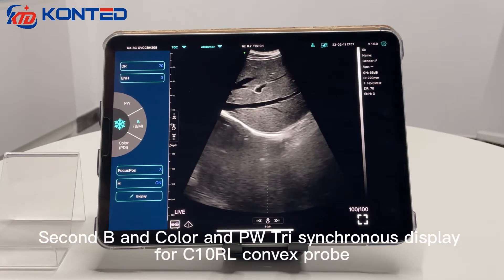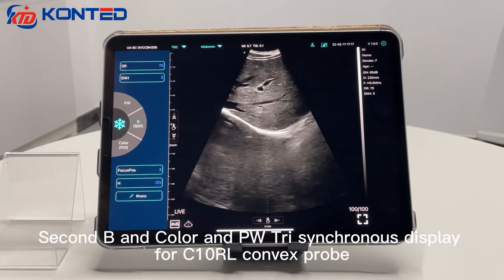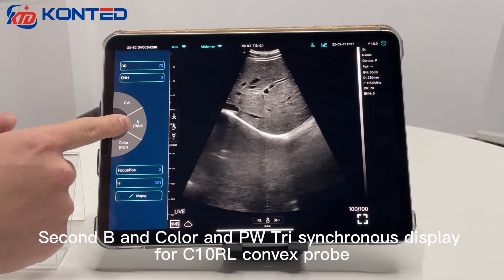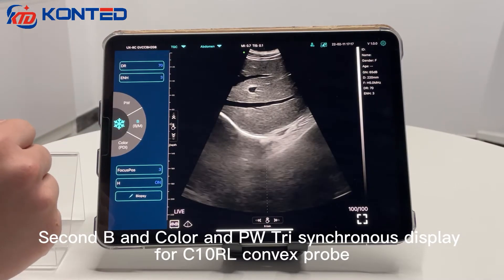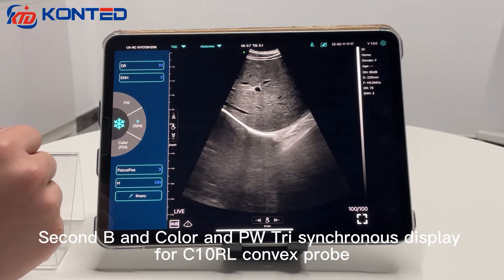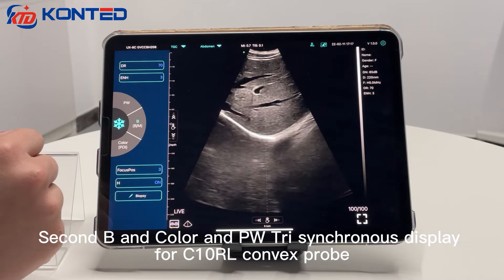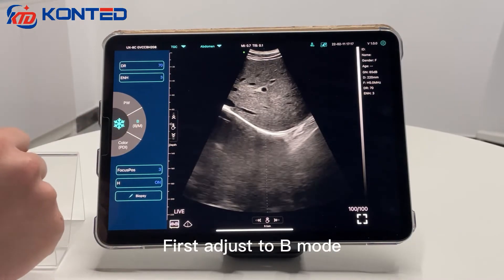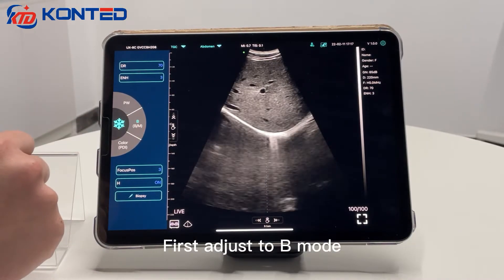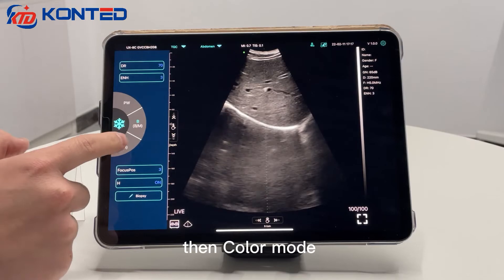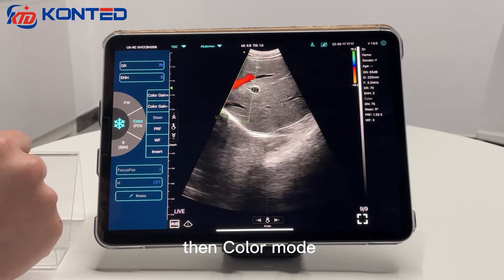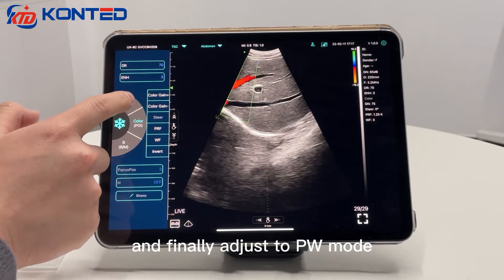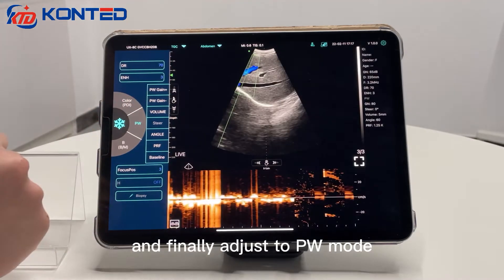Second: B, Color, and PW three-mode synchronized display for the C10RL convex probe. First adjust to B mode, then Color mode, and finally adjust to PW mode.